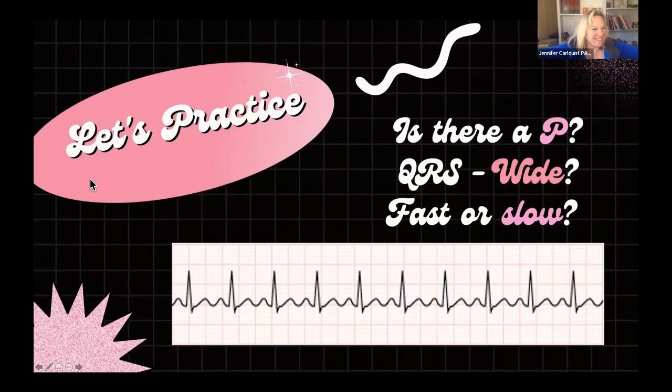Yeah, okay, everybody's saying maybe it's flutter. Okay, so let's talk about that. To really see if something is flutter, you really want it a little bit faster. This was not flutter, this was sinus tach. But to tell if something is actually 2-to-1 flutter, you really need to look at V1 on a 12 lead. This was not V1, unfortunately. But when it goes fast, around 150, you have to consider SVT as well. You have to consider SVT when it goes really fast, okay? This actually was sinus tach. We can still see the P waves. Usually SVT is going to be a little bit faster. So the differentials will be sinus tach, SVT, and 2-to-1 atrial flutter.